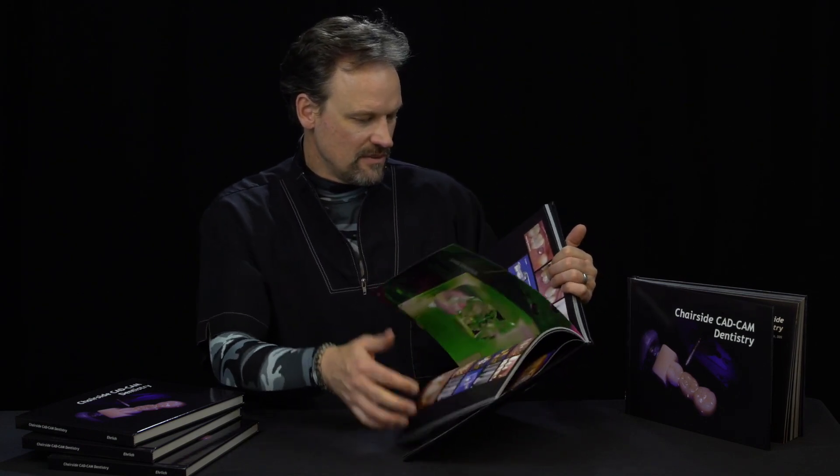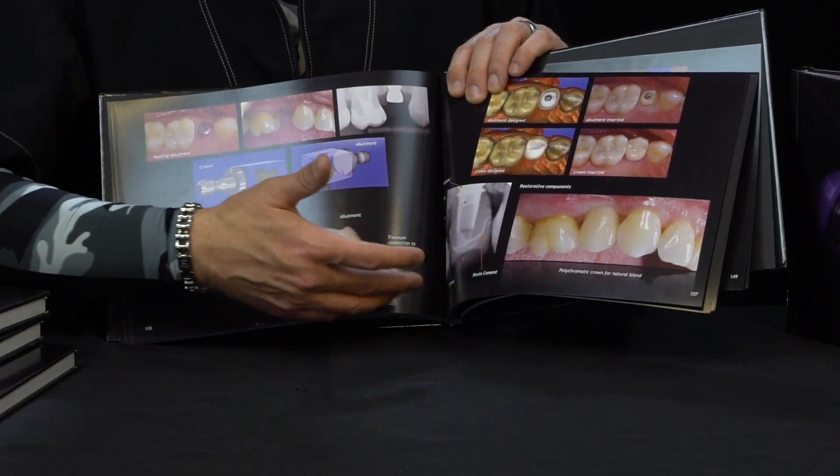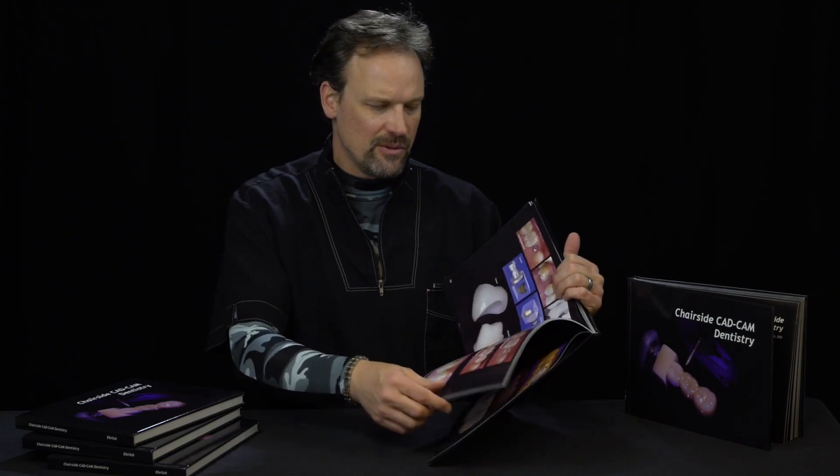There's one really good section that explains what the crown is, the abutment, shows the tie base, and even what it looks like on the x-ray. It's an easy way for a patient to look at and understand the components and really what they're paying for.